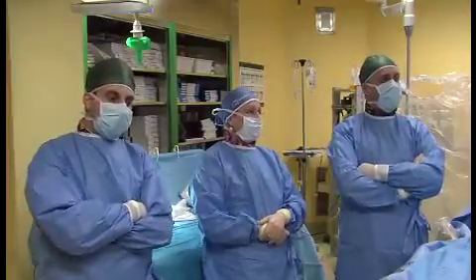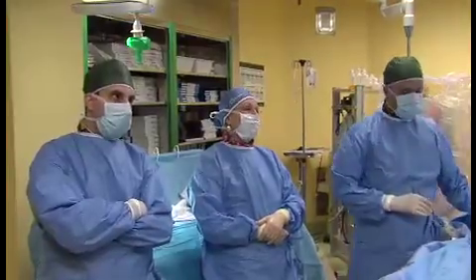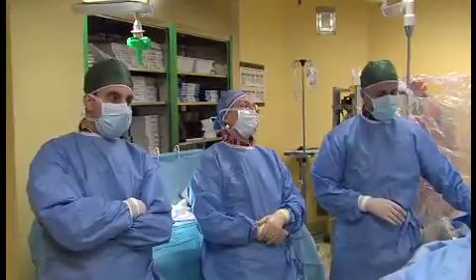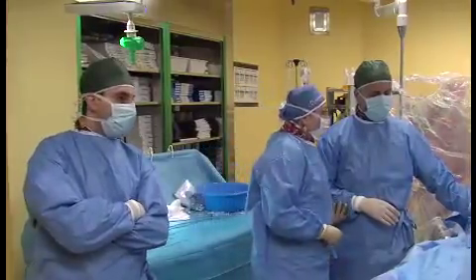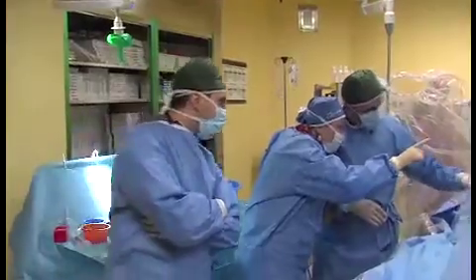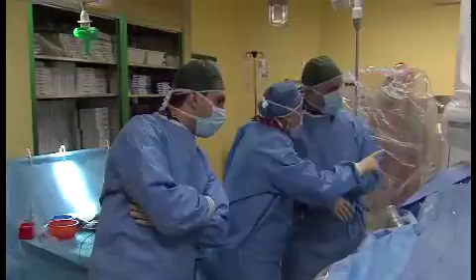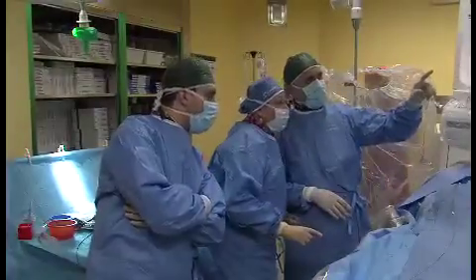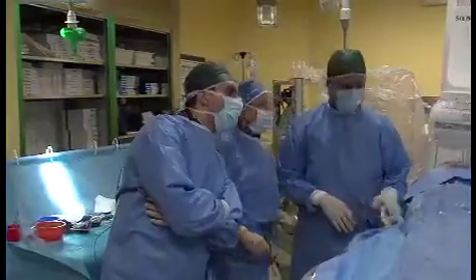And then the other thing is, I haven't seen the straight one, but the normal one with the open crowns at the top, do you intentionally try to put that as far up into the pulmonary branches as possible? Because that's a site of perivalve leak, because there's no pericardium on that. I mean, it's just on the surface, so it's open. So I just imagine some of our patients, it would potentially leak around there if you weren't way up, and so the covered part is kind of at the MPA junction.